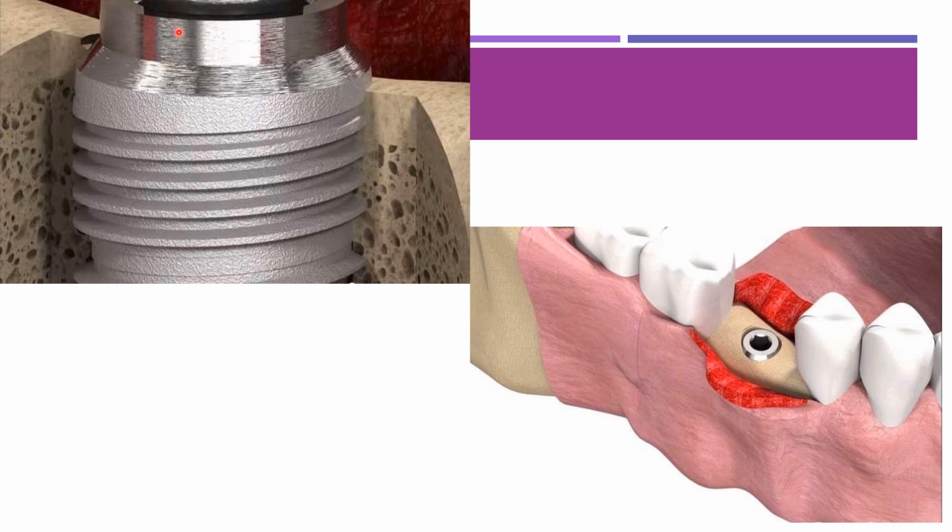The upper implant shoulder should be seated at the bone surface if it is a submerged implant. Otherwise, for non-submerged implants, the healing implant shoulder will be at a slightly higher level. You can see that this is the submerged type of implant, with the implant at the bony margin. You can see that this implant has been placed.